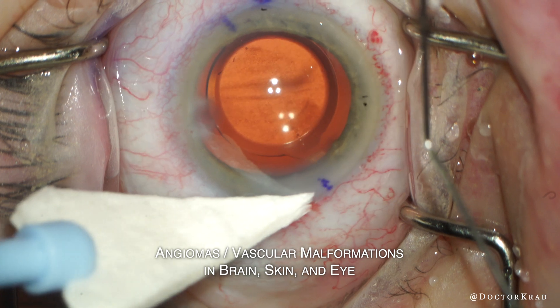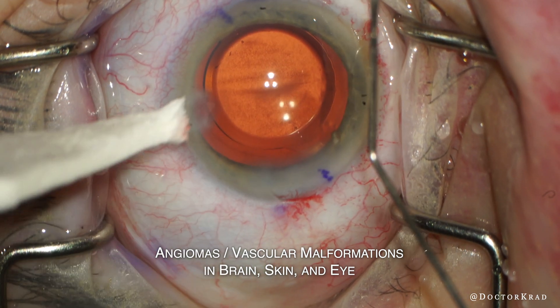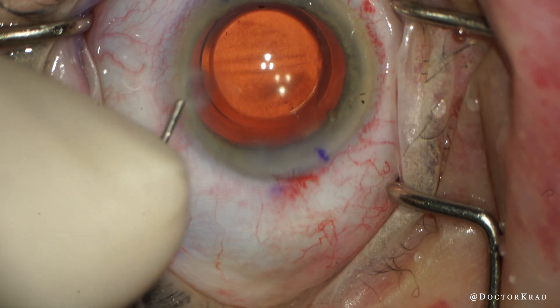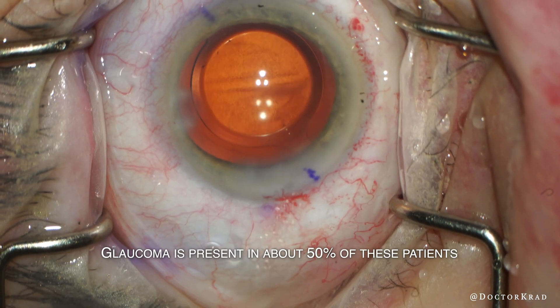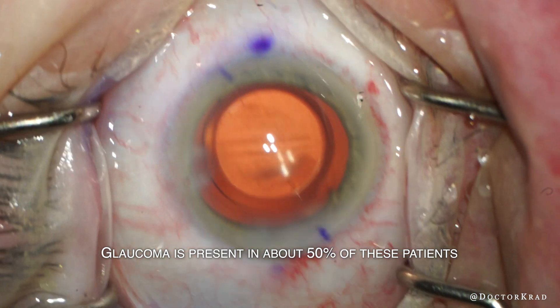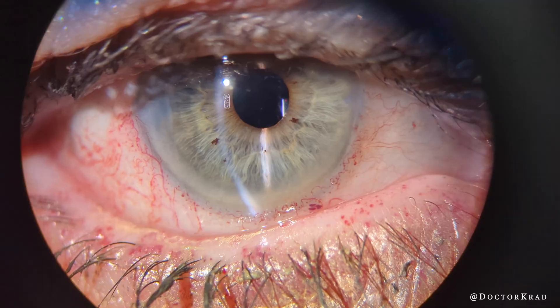The toric lens implant is well aligned. At this point I'm just watching the eye and making sure there's no more bleeding. I'm decreasing the pressure slowly to a minimum of around 20 — I don't want to drop it too low because there's a higher chance of bleeding. Glaucoma can be present in about half of these patients, so they need regular monitoring. I'll show you what she looked like post-operatively in clinic.